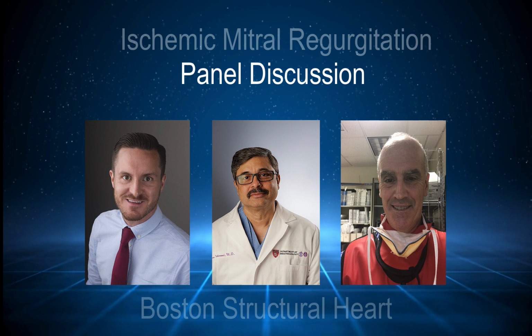They are acquired at different time intervals, so there's a temporal dyssynchrony between the two. When the leaflets are closest may not necessarily be when the jet is widest. So it's basically a superimposition of information or an after-the-fact reconstruction. That's my skepticism, and your points are well taken, that same thing is applicable to 2D also.